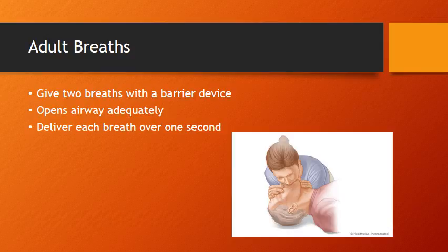The next step in our CPR process is to provide 2 breaths by using a barrier method.